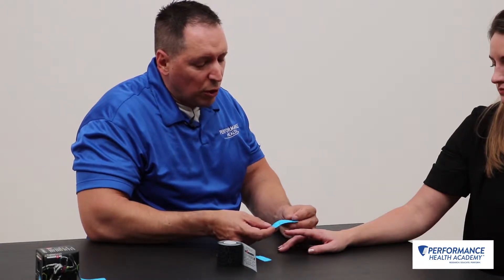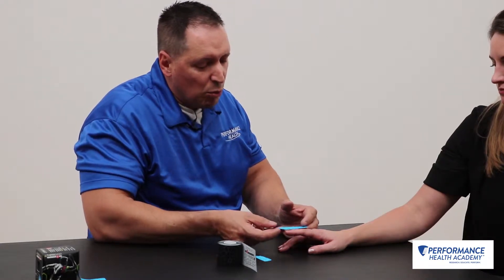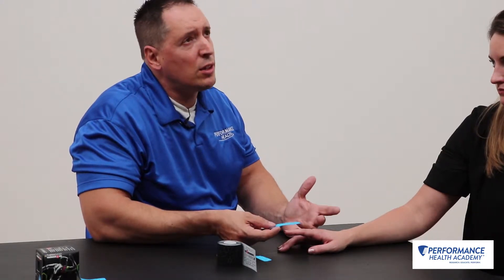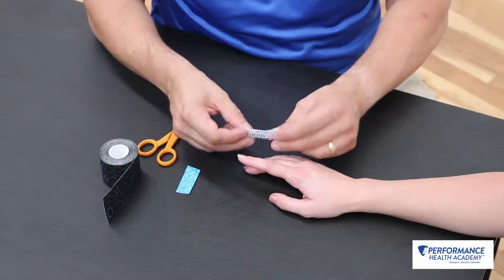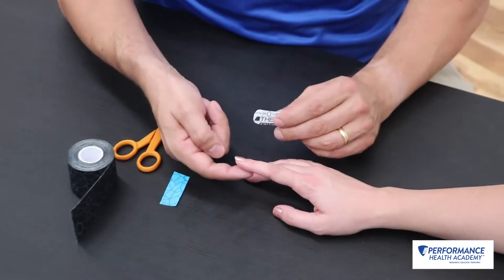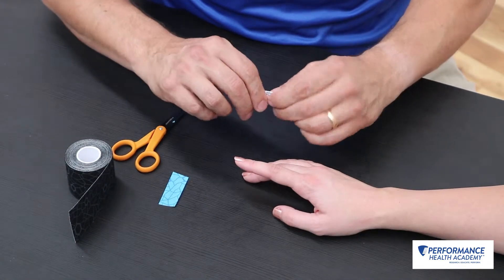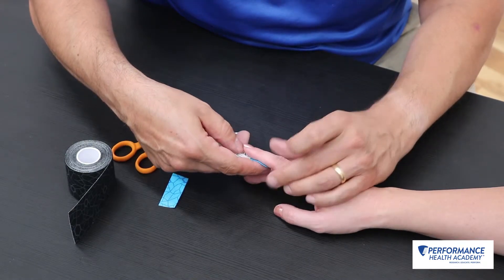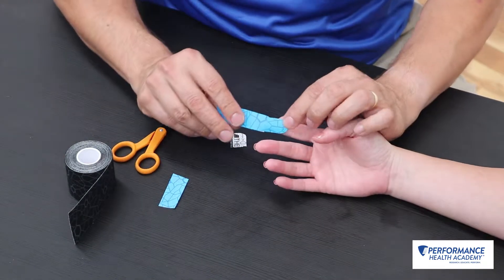This taping technique is useful after the wear time for the mallet finger orthosis is up, maybe at your week 8 to 12, somewhere in there. What we're going to do is take a one to two centimeter band-aid strip or eye strip along the volar aspect of the digit, the DIP joint.